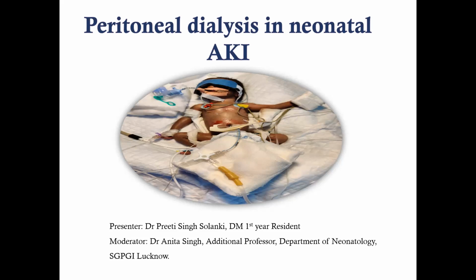Exactly. If hyponatremia is there along with the AKI, which is quite obvious, in AKI dilutional hyponatremia occurs because of fluid retention in the body. So if your dialysis is doing adequately, the extra fluid in the body would be taken care of, and that's why your sodium would be corrected. So routinely, there should not be any need for alteration of the sodium concentration in the PD fluid.